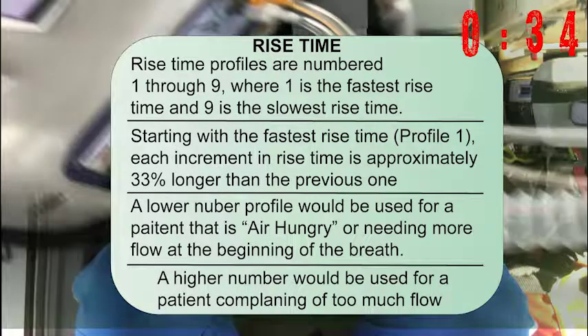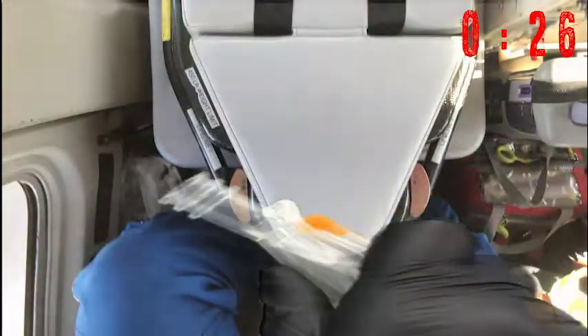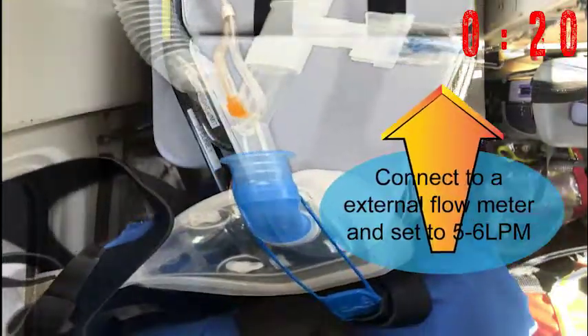Now to connect the SVN, make sure that it's connected to the inhalation port side of the vent circuit tube — that's going to be the long tube. Connect the T-piece, then connect your nebulizer and make sure it's connected to an external flow meter.